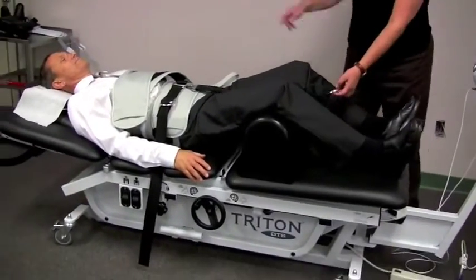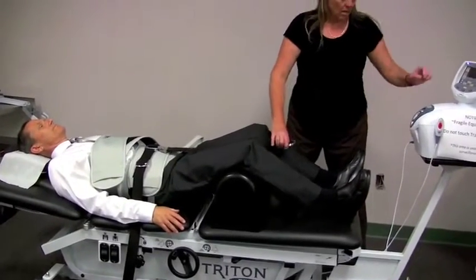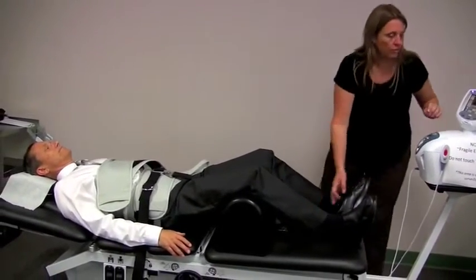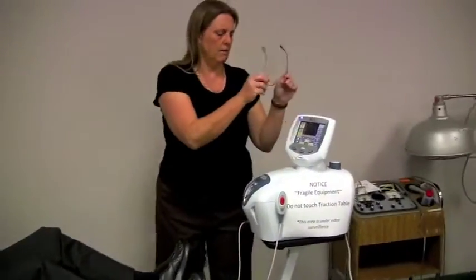When you lower those pieces, you have to put the arm piece down first and then the head piece. The next part is I have to hook the rope. So come on over here, Lisa, and let's look at this together.